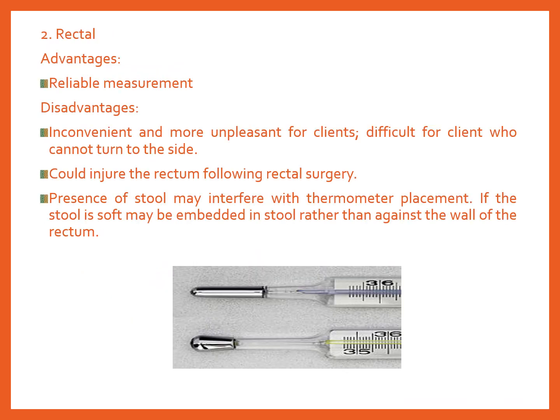For rectal, the advantage is that it's a reliable measurement. The disadvantages are that it is inconvenient and more unpleasant for clients, and difficult for clients who cannot turn to the side, because we need the client to turn to the side. It could injure the rectum following rectal surgery. The presence of stool may interfere with thermometer placement. If the stool is soft, the thermometer may be embedded in stool rather than against the wall of the rectum.